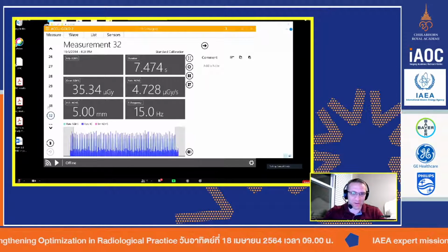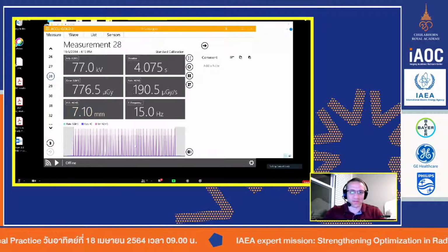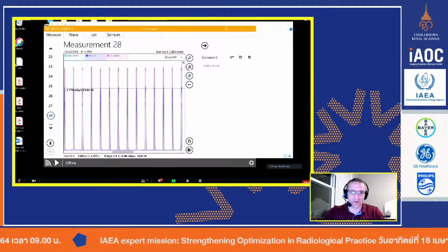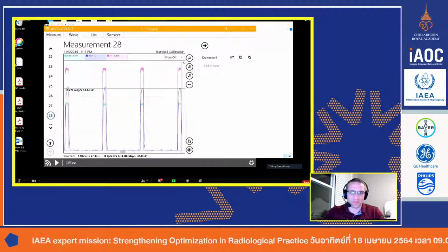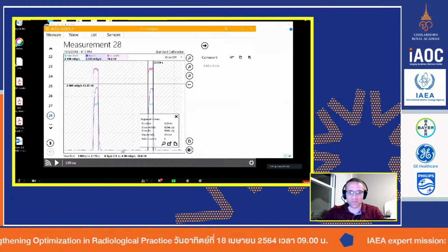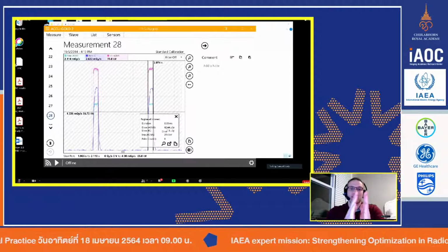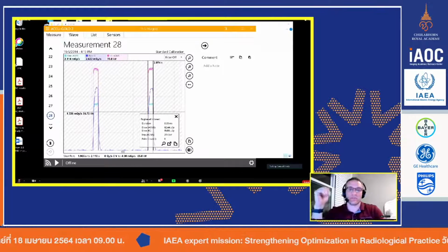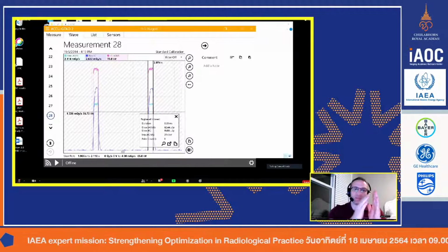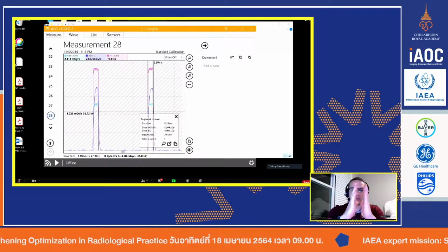Here you go. Here's 15 pulses per second. So in this case, we can go look at how wide these pulse widths were. See, now you can see the pulse width is almost 6.5 milliseconds. So it had to change that, and for whatever reason, to do it. Now, you would think it would actually allow it to go a little smaller, because if it's 15 pulses per second, they're more frequent, so you can actually reduce the amplitude. In this case, they probably reduced the amplitude instead of reducing the width.